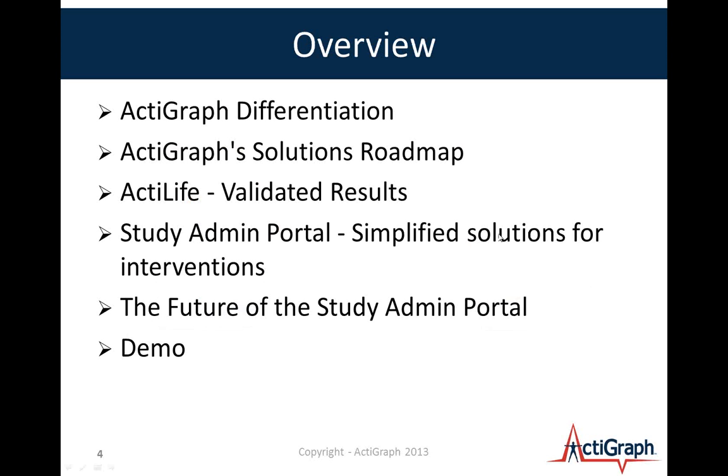Just a quick overview of what we'll cover today. We'll talk a little bit about ActiGraph's differentiation as a company and our products and how they're different from other competitors. Talk a little bit about our solutions roadmap. Go into the ActiLife product just briefly and talk about where it comes from, where the data comes from in there, and then segue from there into the discussion on the Study Admin Portal, which is a brand new tool that we've just begun offering and working with some clients to deploy. And then I want to talk about the future of that tool, and then at the end we'll do a brief demo of the Study Admin tool.